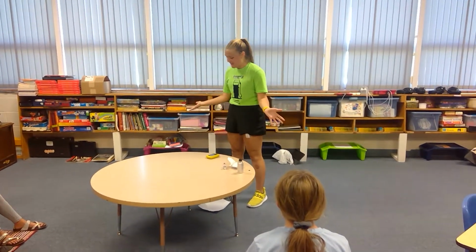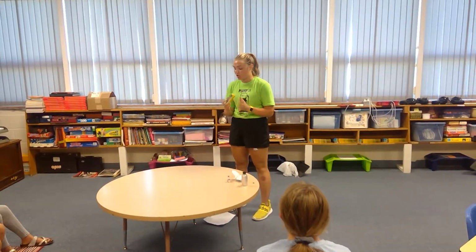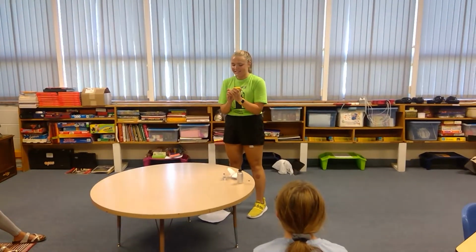Our pump is in. So the next step is the pod is just going to make sure that you did hear that sound. It's really important, otherwise I have to put on a new one. So we're going to say, yes, it did work.